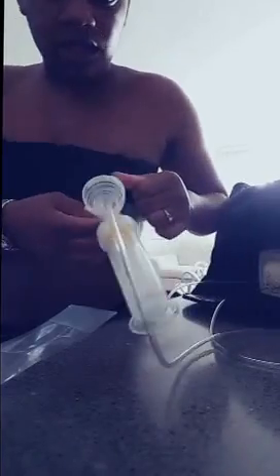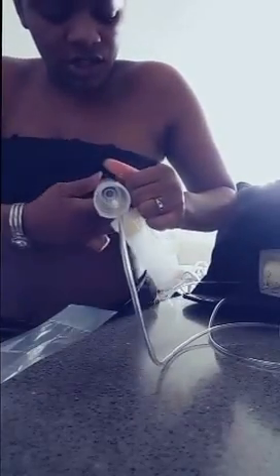Zip it up. Make sure that it fits you securely and comfortably. And now we attach our breast shields. So we're going to do the left side first. And you simply put it under all layers of the bra.